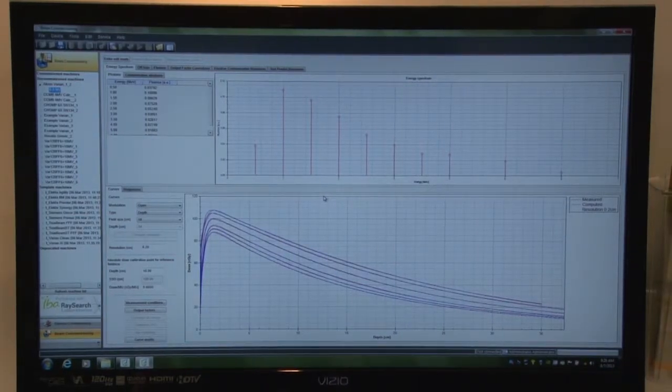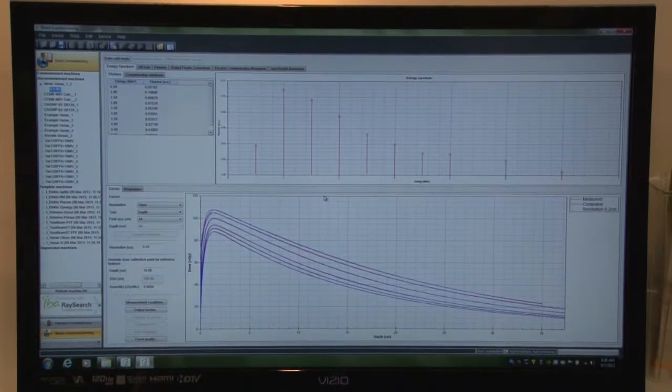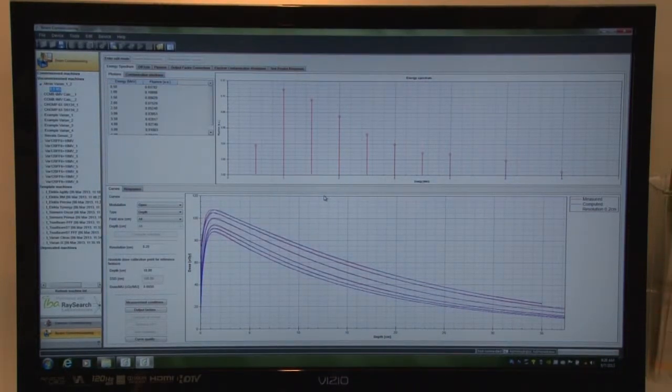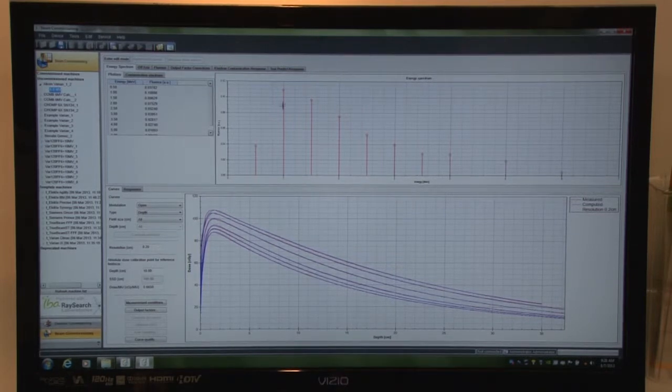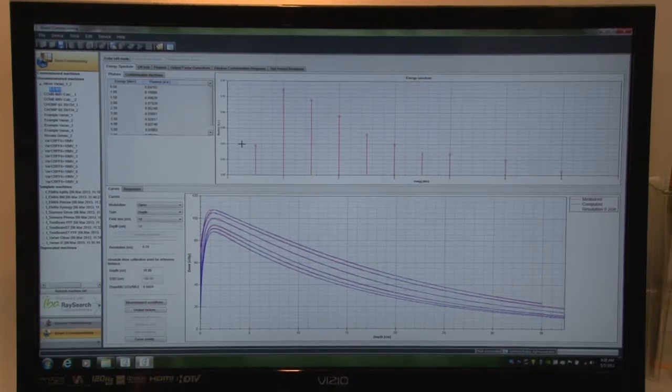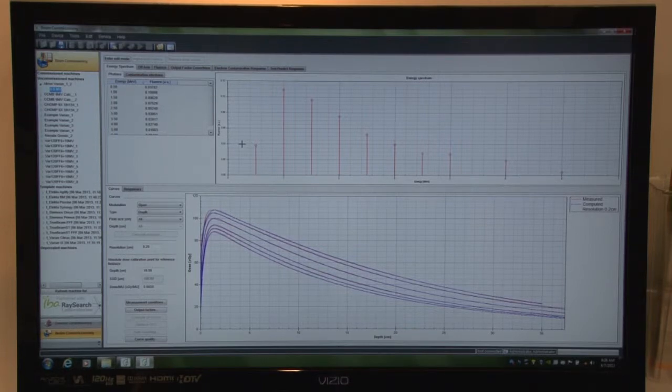So Compass is a tool that allows you to do calculations against your TPS. The way we are able to do calculations is we build a specific beam model, which you can see here, for each energy on your specific machine. So this is very specific to your environment. We simply take raw scan data and from that we are able to build an actual model that fits your machine and your energies.